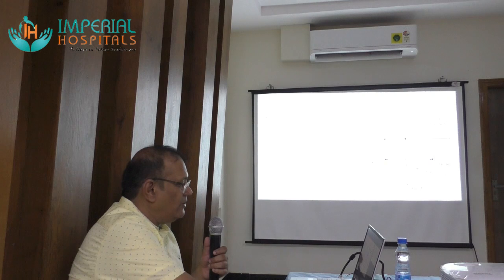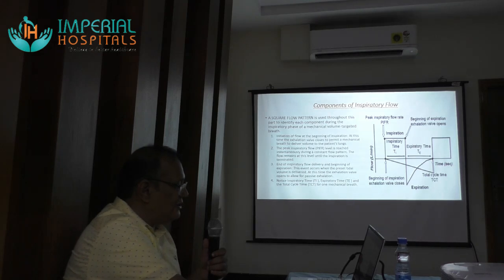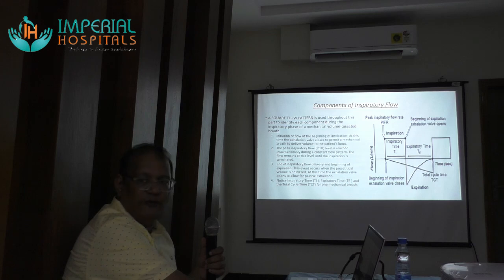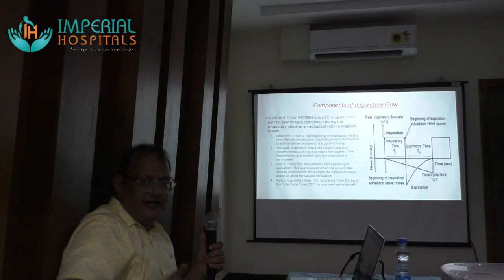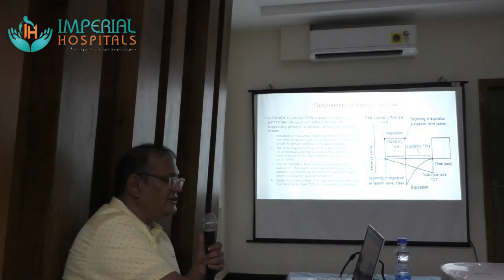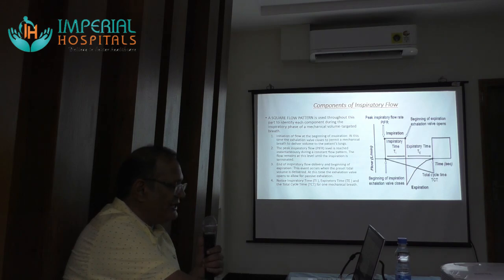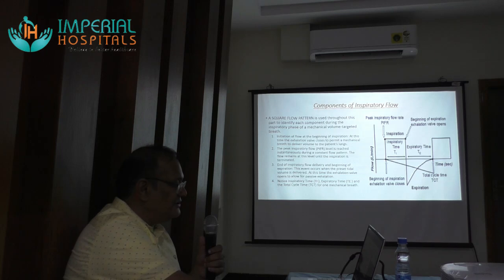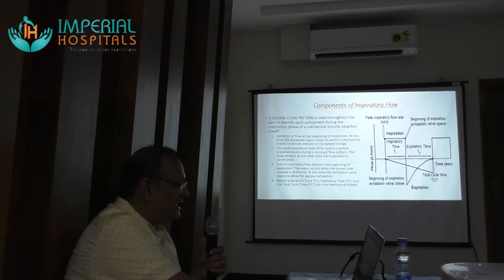And it will keep delivering that amount till the tidal volume that has been set is delivered. And once the breath is completed, the exhalation valve opens, and you will see again a sharp fall. And now because the air is moving away from the lungs of the patient towards the ventilator, you will see a negative graph here. So you can see the inspiratory time. This TI part is the inspiratory time and TE is the expiratory time. TI plus TE is going to be the total cycle time for one mechanical breath.